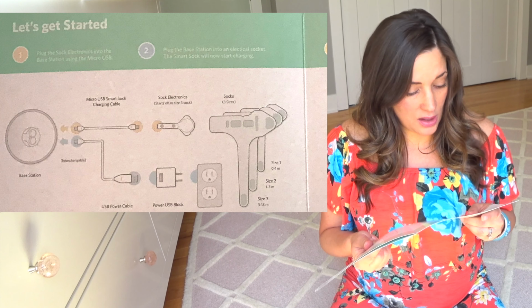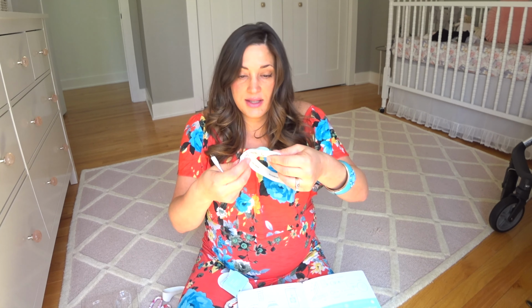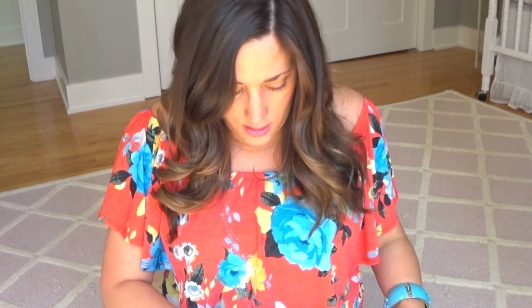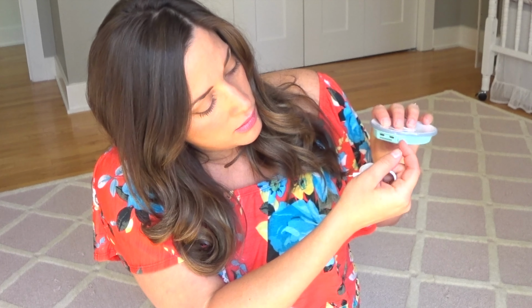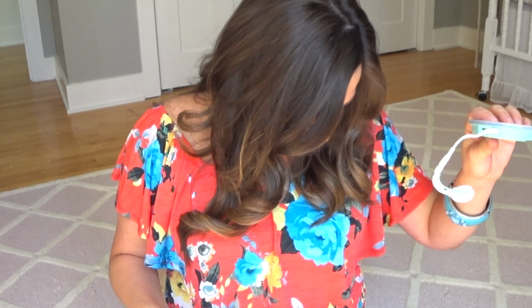Step 1, plug the sock electronics into the base station using the micro USB. So this is the micro USB. Oh, I guess the sock electronic is in here. So you'll see there's a little place to plug that in. And then you plug the other one. Oh, there's a little pull thing to take off, and it says plug the other one in here. So that is step 1.